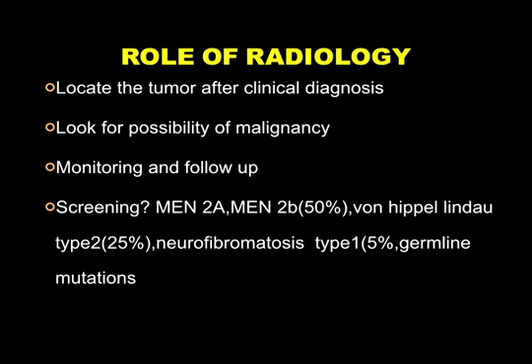So someone mentioned in pediatrics you have a small mass. What do you do about it? We can follow up in radiology. We want to see whether it is rapidly increasing in size. We look out for signs of malignancy. Is it invading adjacent structures? So we tell you now is the time to work on the patient.